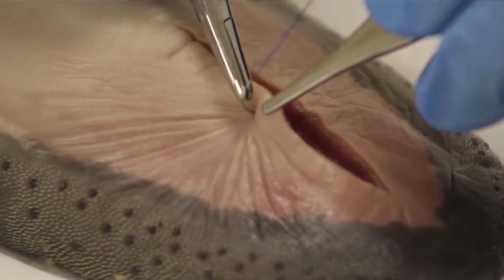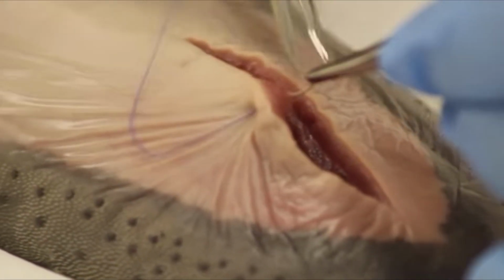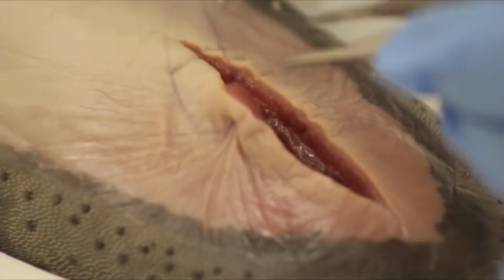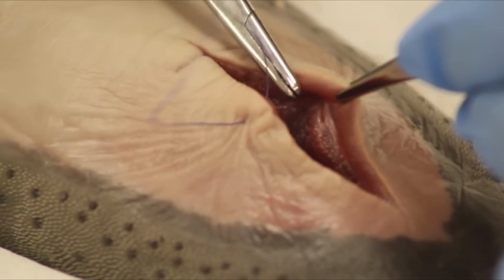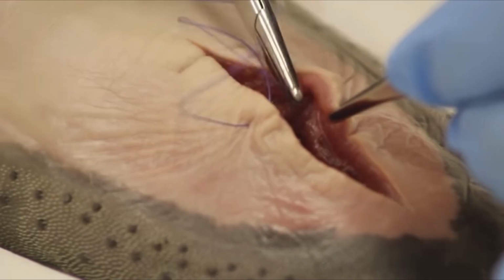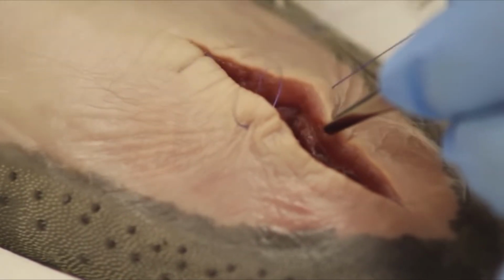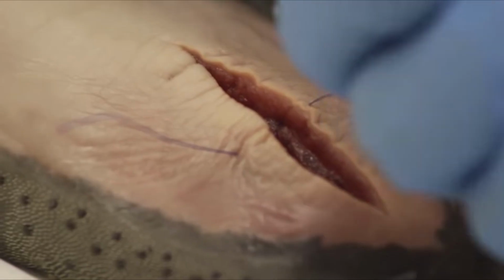Drive the needle with a smooth wrist rotation, following the curve. The goal is to capture more depth at the base than at the surface, which helps create slight eversion and stronger dermal purchase. Now mirror that on the opposite side. Take a bite that matches the first one in distance from the edge and depth. Symmetry matters. Equal bites bring the edges together at the same level.